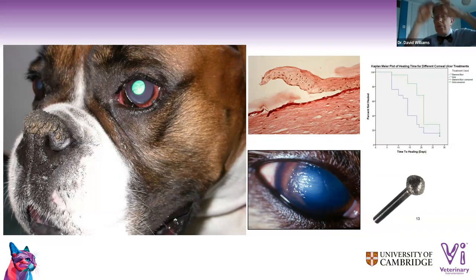It may take a month to do as the sutures eventually dissolve. And that's why they use maybe 4, maybe 5 naught Vicryl as the sutures. The 6 naught dissolves a bit too quickly. So 5 naught, maybe even 4 naught stays there. And then eventually, as you say, Philippa, yeah. So I would leave the graft on until it heals underneath. You don't need to remove the sutures. It's absolutely fine, works really well.